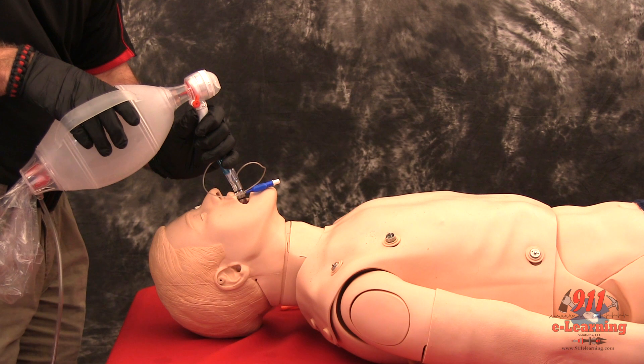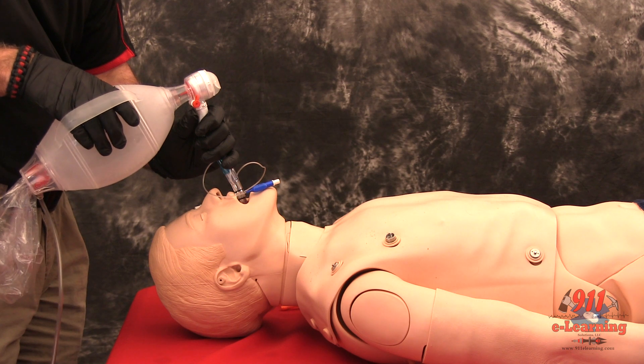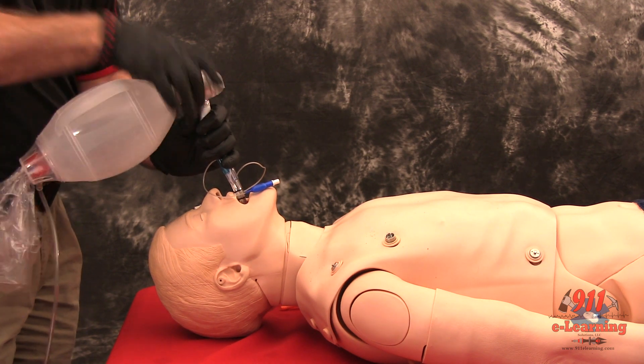If breath sounds are negative and epigastric sounds are positive, attempt ventilation through the shorter number 2 white tube and reassess for lung and epigastric sounds. If breath sounds are present and the chest rises, you have intubated the trachea and should continue ventilation through the shorter tube.